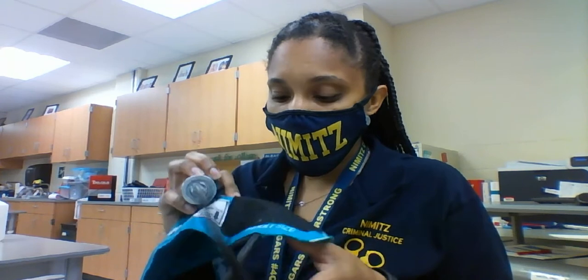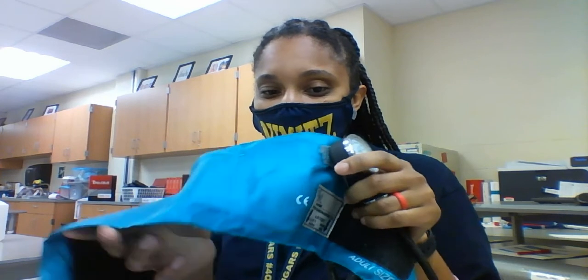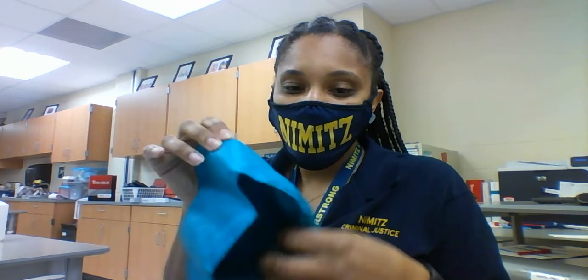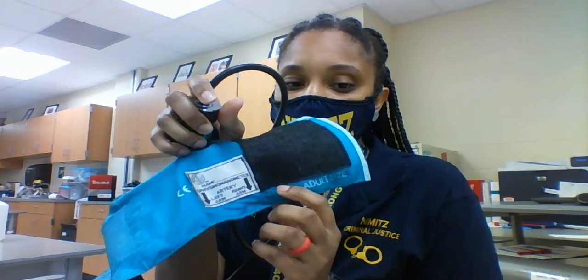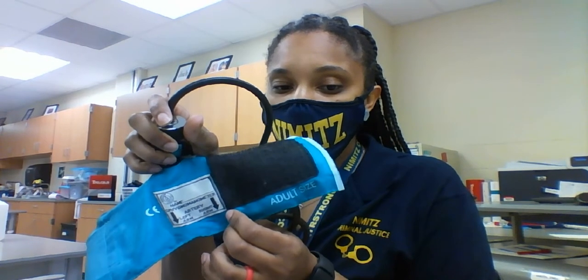Also, when you're taking your blood pressure, there's generally going to be an arrow on the cuff. There it is. So you're going to put this on whatever arm it says.